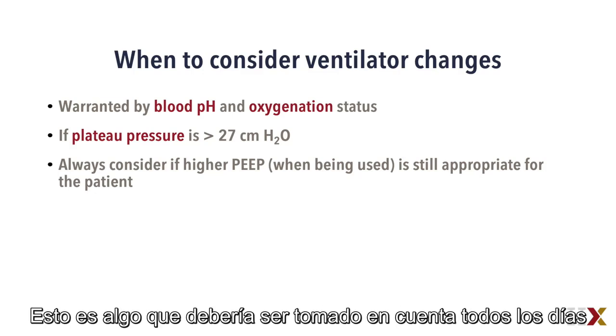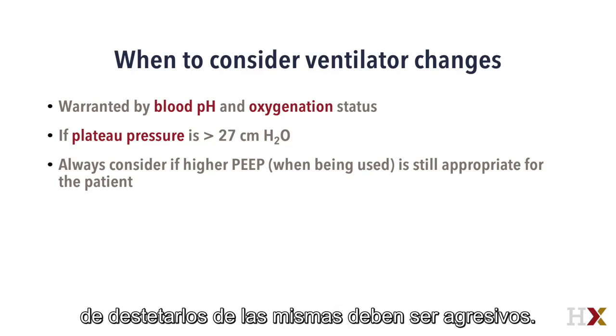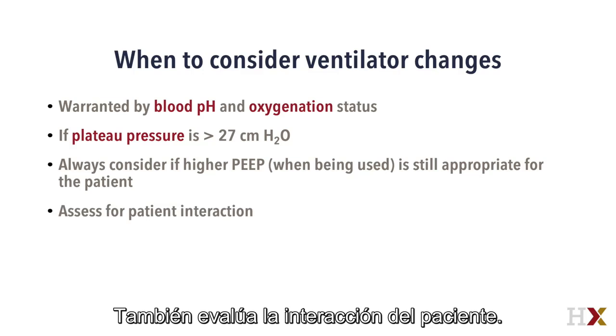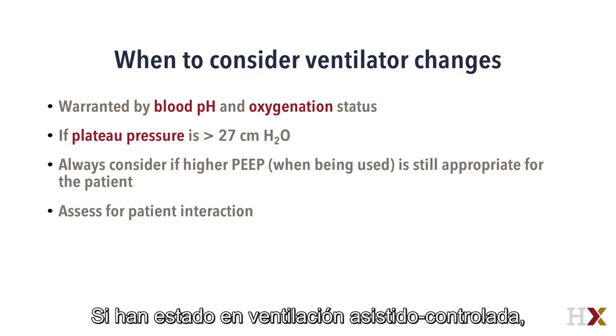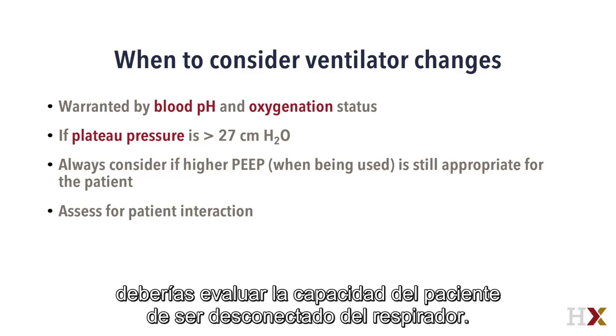This is something that should be considered every day when higher PEEPs are being used, and attempts to wean them should be aggressive. Also assess for patient interaction. If they have been on an assist control mode, if they have now started triggering the ventilator, you should assess the ability for ventilator liberation.